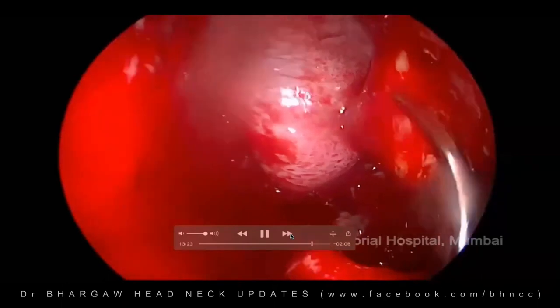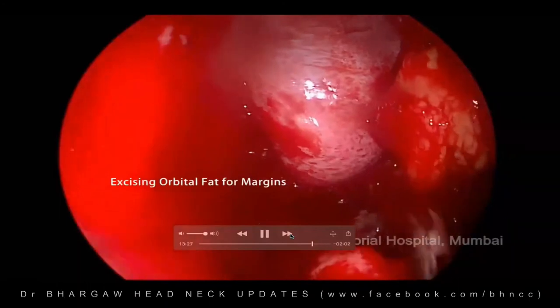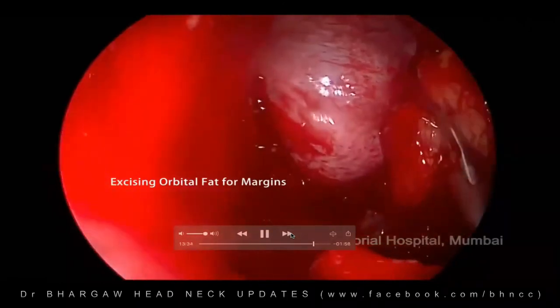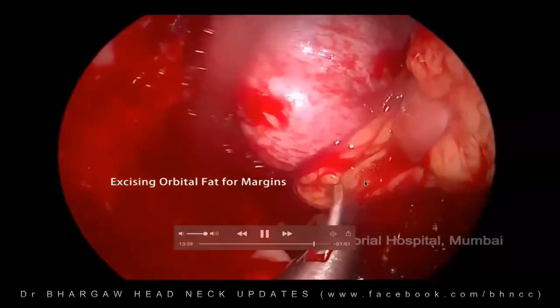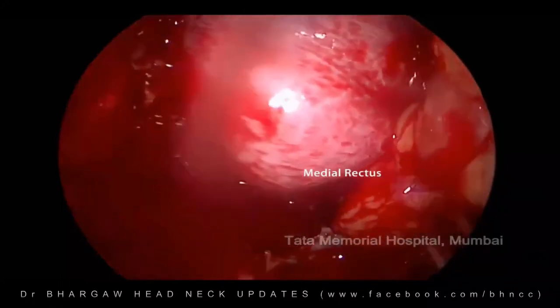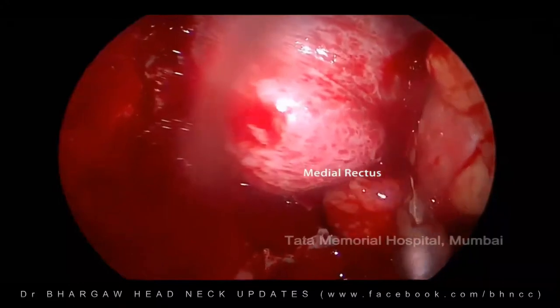and once that is done, that's when we decided to remove the fat. In the meantime, it was sent for frozen, and there was disease, but we just wanted to confirm. You'll see the medial rectus muscle coming into view there. We inked this surface and sent it, and that was negative, so we stopped right there. We didn't go beyond this. So that's the medial rectus there. That was inked and sent for frozen.